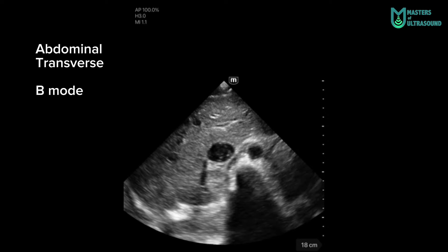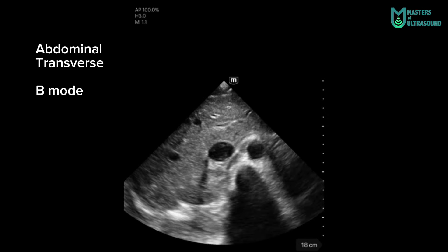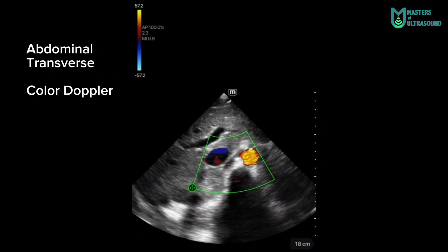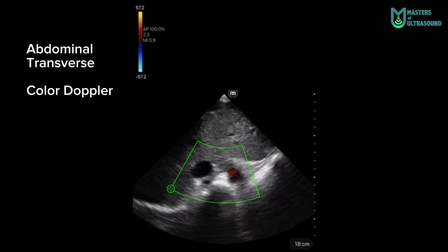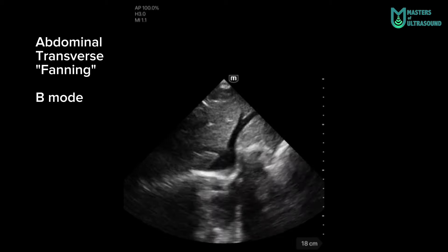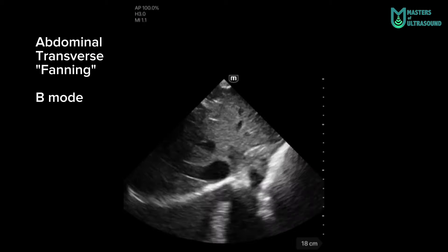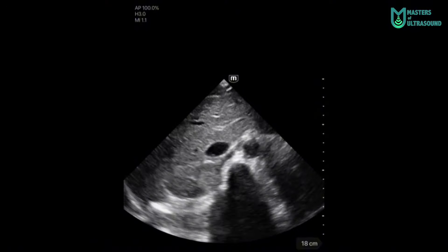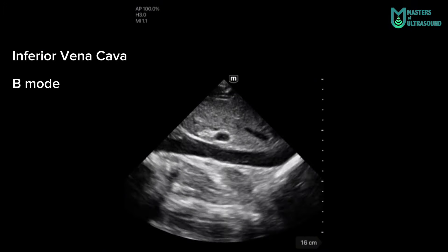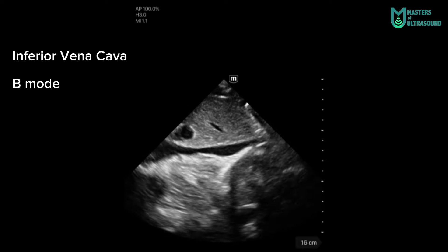Here is an abdominal transverse view. You can see the liver and the inferior vena cava, and the pulsatile aorta at the right, colored in red — not because of arterial blood but because of the flow direction. Here you can see a quick abdominal transverse fanning showing the suprahepatic veins and portal veins, and the collapse of the inferior vena cava in inspiration.